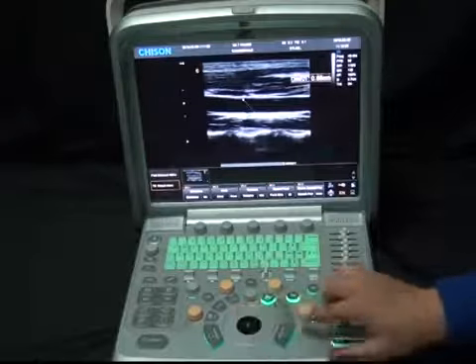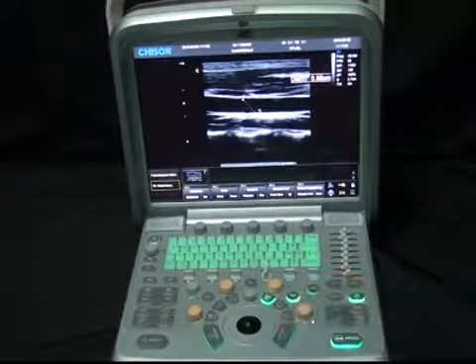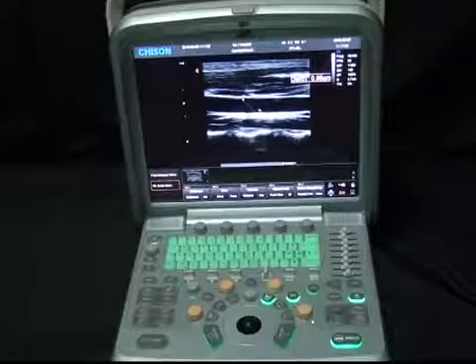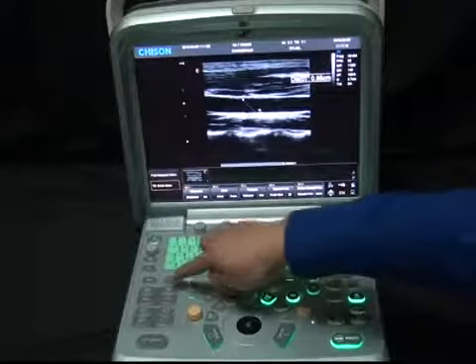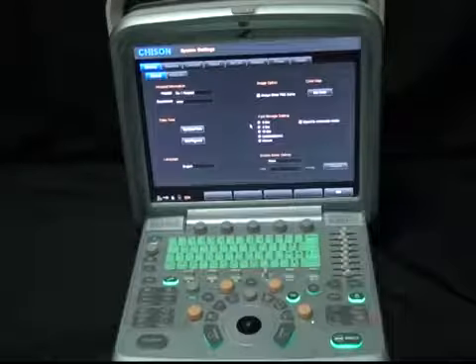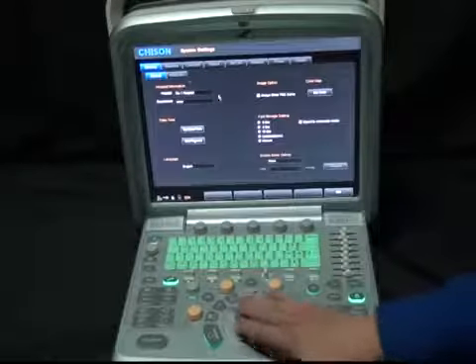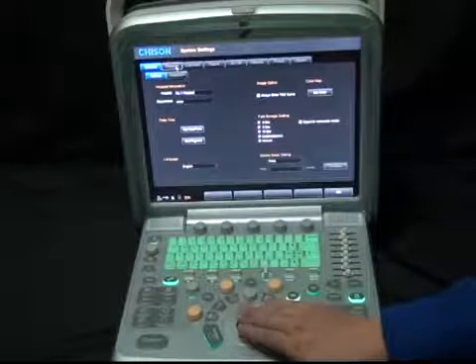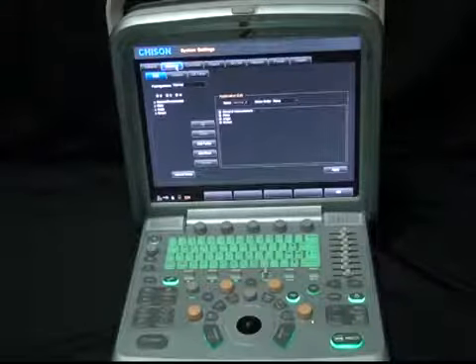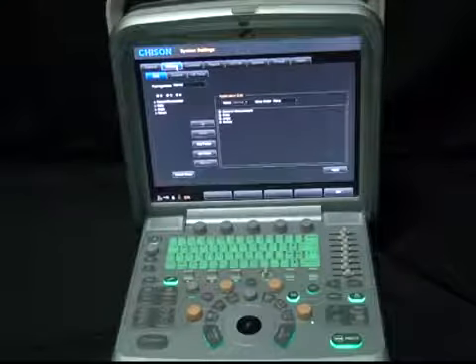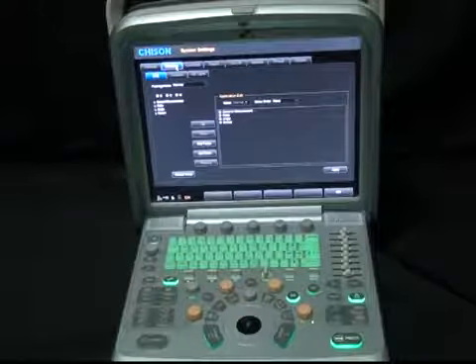What's more, we can do user-defined calculation packages. Press the Setup key and choose measurement. In this interface, you can add or delete calc items.